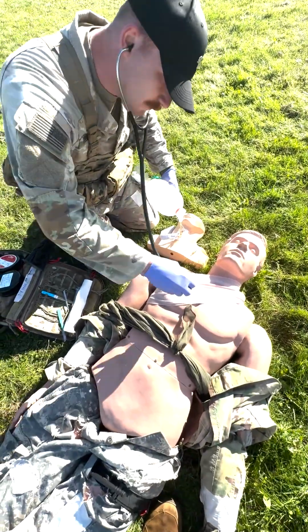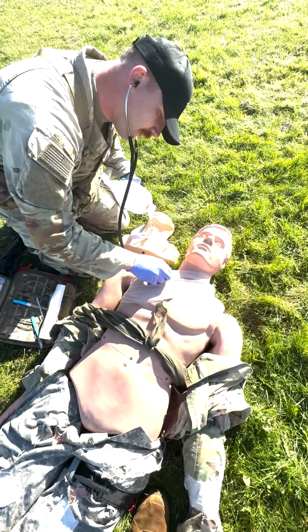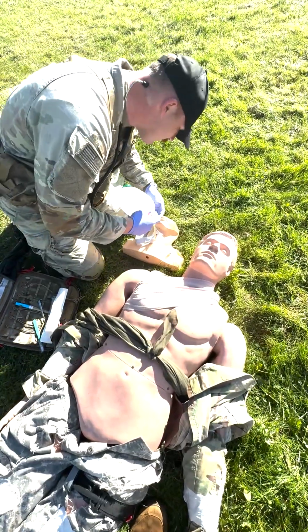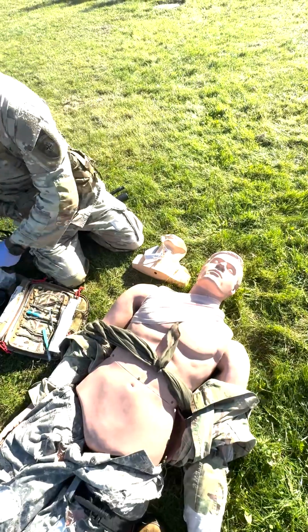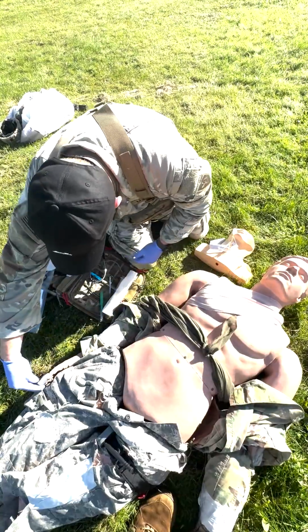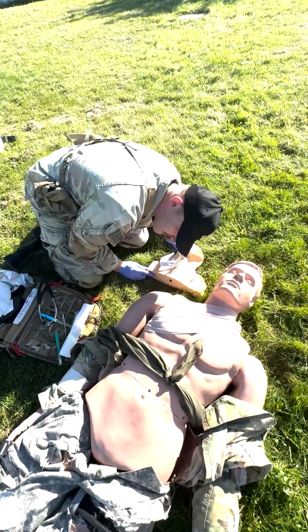Alright, go ahead, auscultate the apexes of the right and left lung. You hear breath sounds in all lung fields. Right, perfect. I have breath sounds in all lung fields. I'm now going to check my patient's pulse ox and respirations. Pulse ox is on there. I'm going to check for spontaneous respirations for 10 seconds.